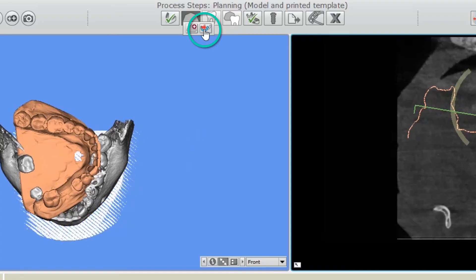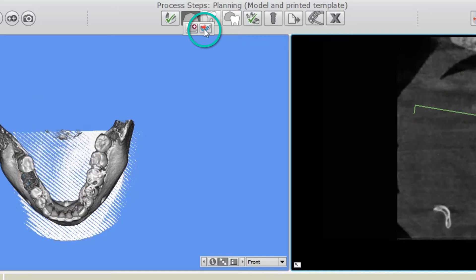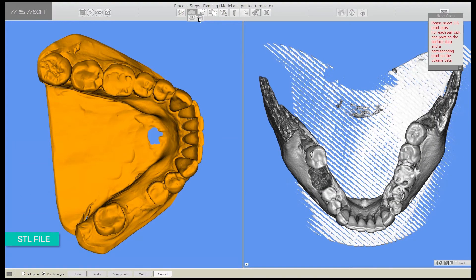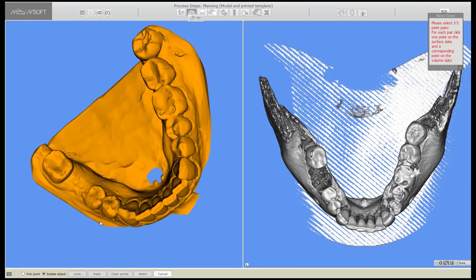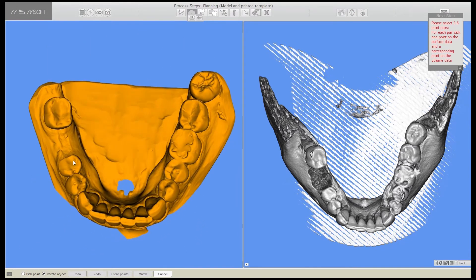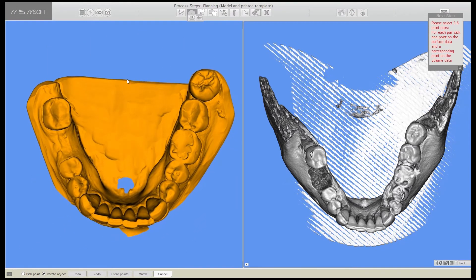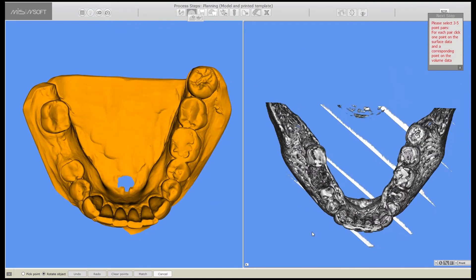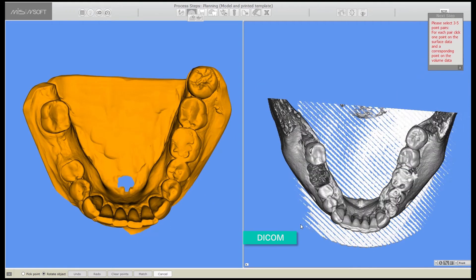Now let's click on the rough positioning button. You will see two windows side by side. On the left is the STL file window, which you can see me moving here. On the right is the DICOM.